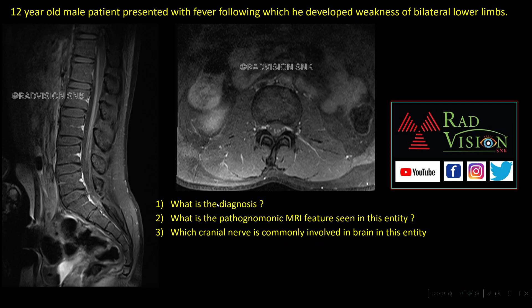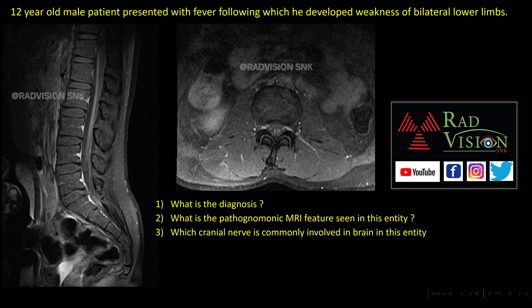Next — 12-year-old male presented with fever followed by weakness of bilateral lower limbs. Here you can see enhancement noted along the cauda equina and conus medullaris — typically enhancement of the anterior nerve roots in the cauda equina region. The diagnosis is Guillain-Barré syndrome. The pathognomonic MR features are nerve root thickening and contrast enhancement of the conus medullaris and the anterior nerve roots of the cauda equina. The facial nerve is commonly involved in this entity.